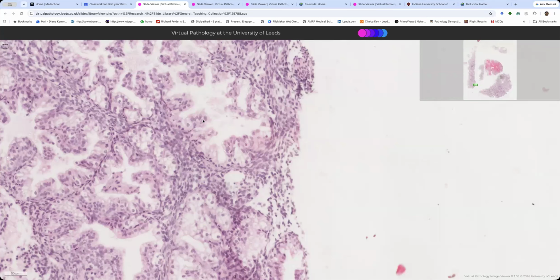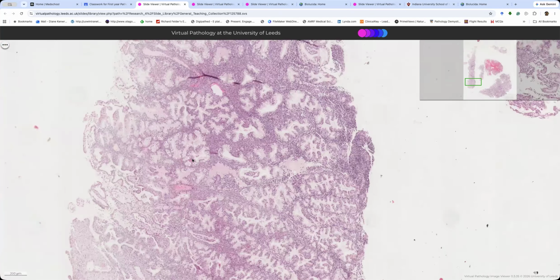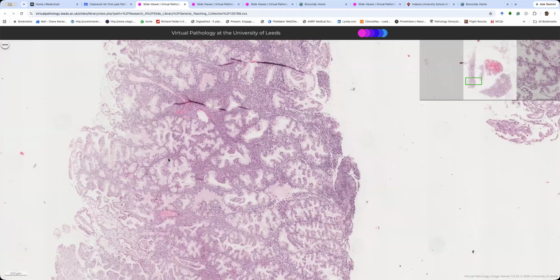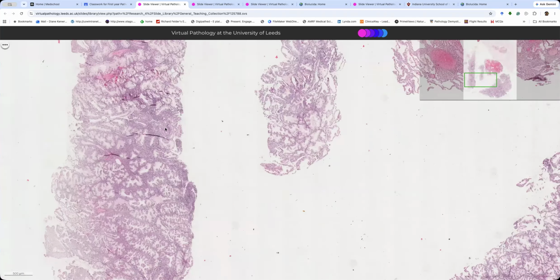Clear cell carcinoma is hyperchromatic, very atypical, sitting in the middle of the clear area of the cells, as many of these are, but these are not hyperchromatic. They can be a bit enlarged, but they are still quite smudgy chromatin. Okay, so this is an Arias-Stella reaction, hypersecretory reaction.